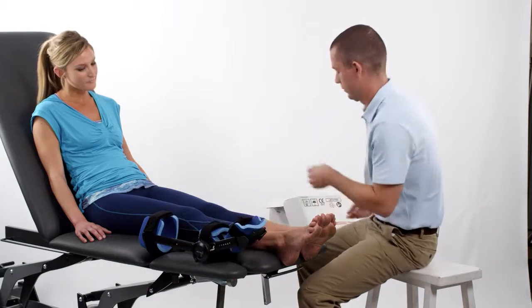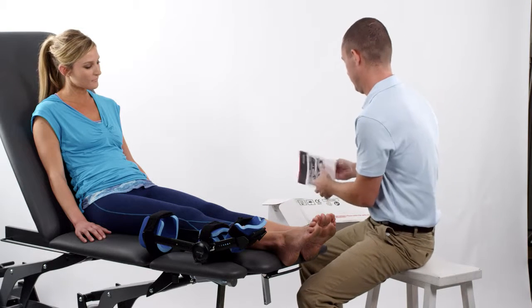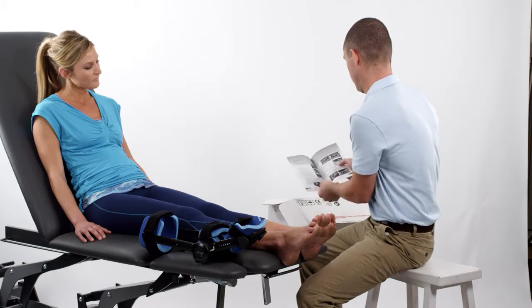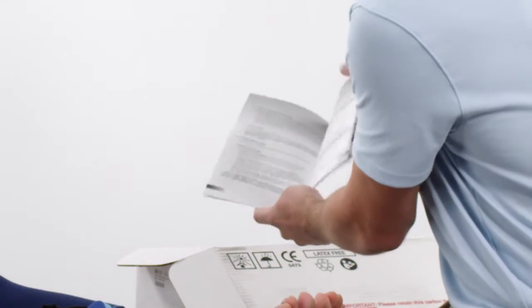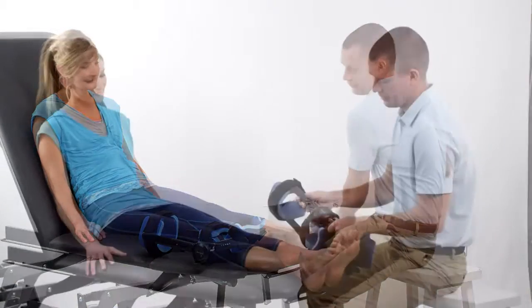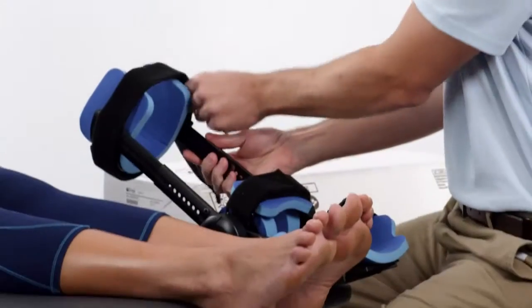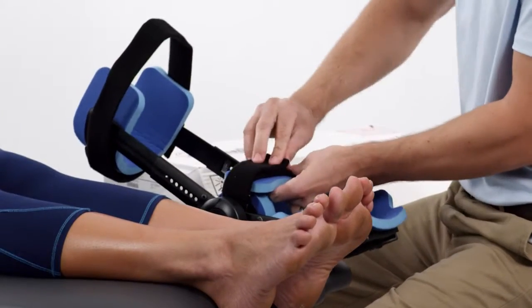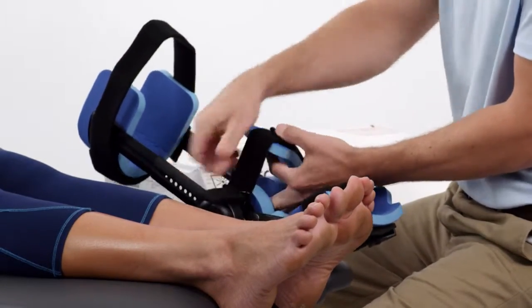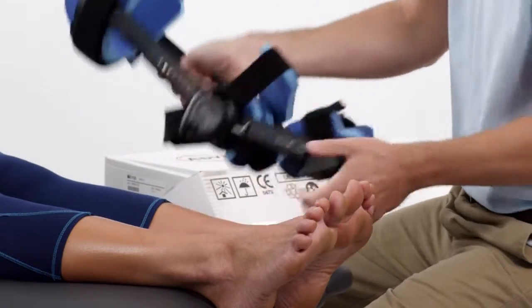Then review the features of the Advanced Ankle Orthosis. The instruction manual features a diagram that explains the components and performance benefits of the device. At the initial fitting, loosen the adjustment straps on the contour cuff, the ankle foam pad, the heel cradle, and the footplate cradle.